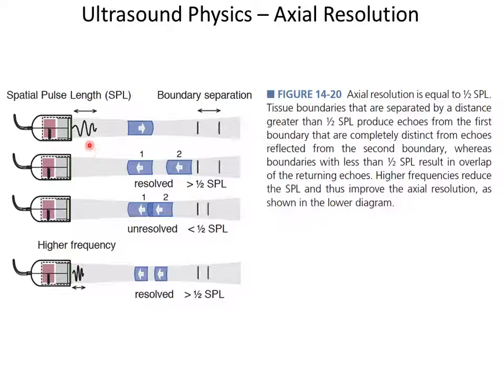So we're going to take our transducer and go ping, and that makes this burst of energy at our frequency. This wavelength here is, say, 10 megahertz, right? However, the duration of that 10 megahertz pulse is relatively short. So it's like a burst of 10 megahertz energy, and it will travel through my medium.